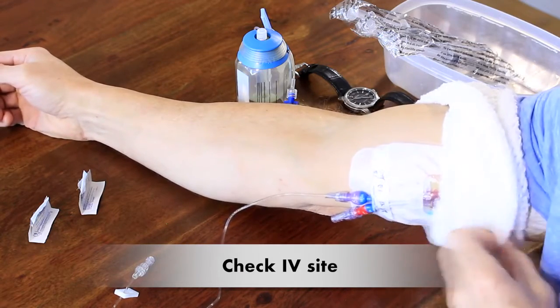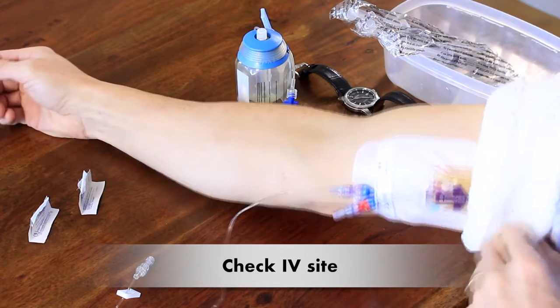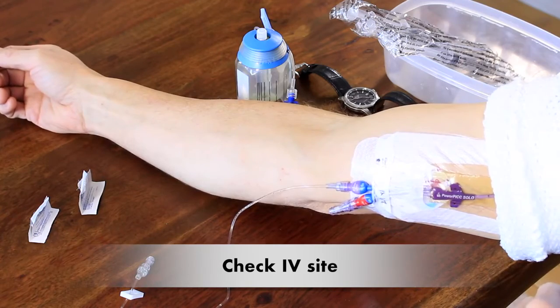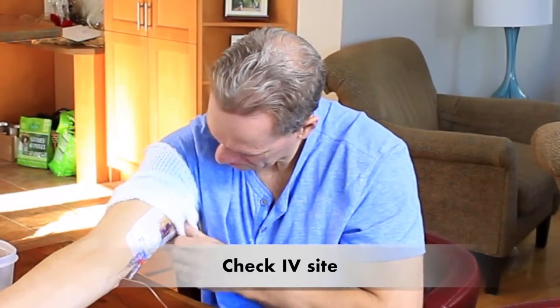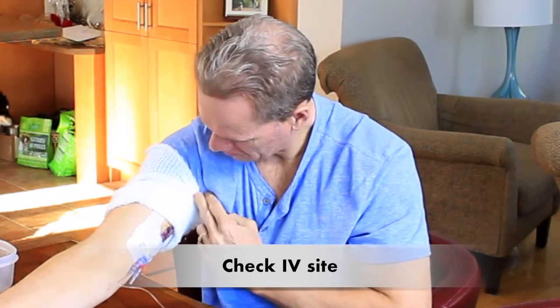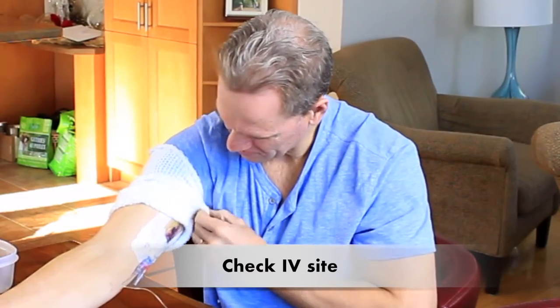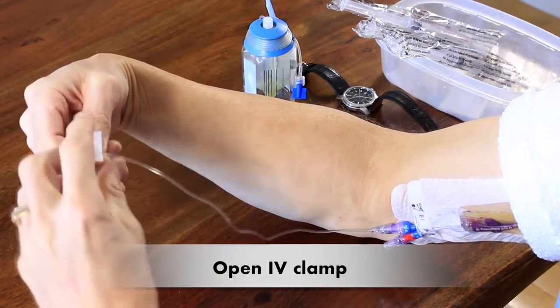Have a look at it and see, is it red or sore? Is there any fluid under the bandage? Is your arm swollen? Check to make sure that the bandage is sticking well and it's clean. Now you need to touch your arm just above where the IV is to make sure it doesn't feel hard or sore. If it's not, that's wonderful. You can continue on. You need to slide the clamp that's on your extension set open, if it wasn't already open.